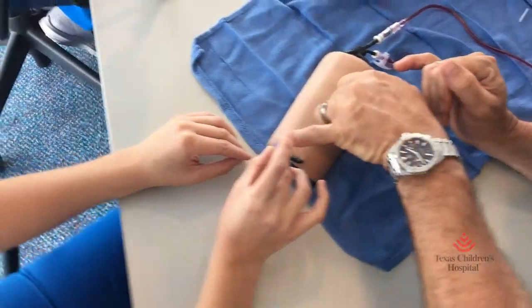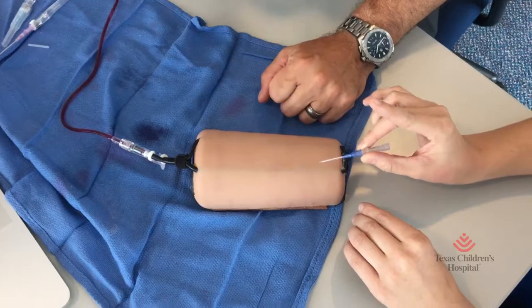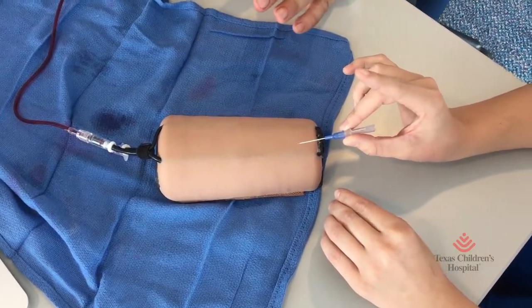This finger, when you get good, will be used to pop that catheter in that vein when you get flash. But initially we don't want to do that because that takes some training.